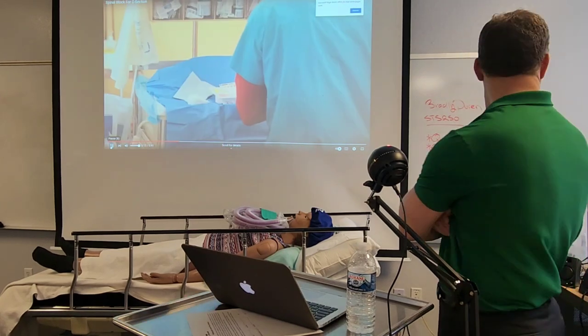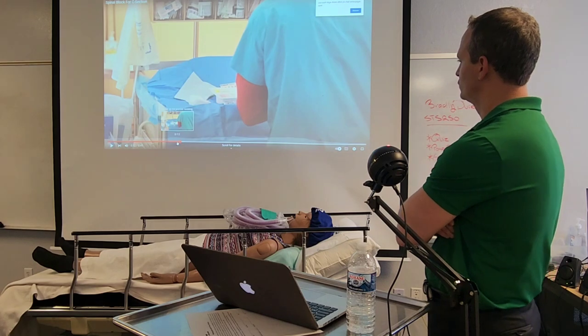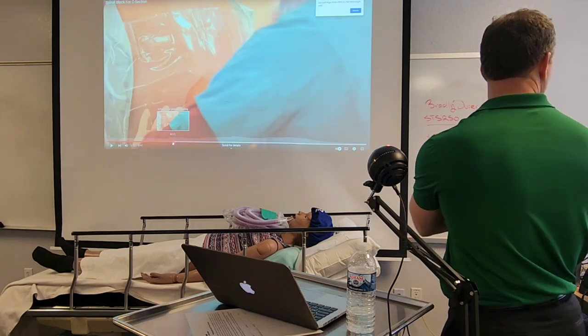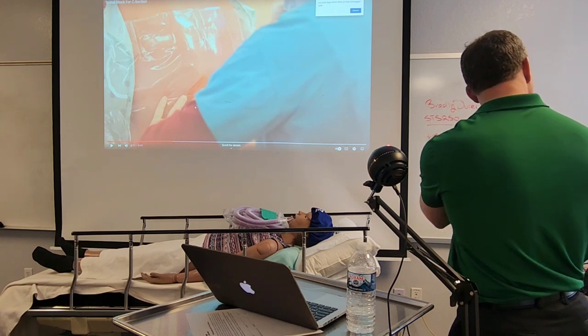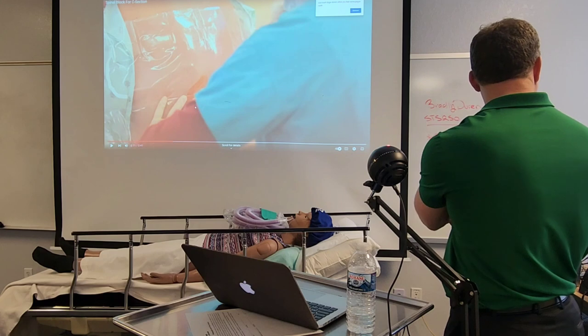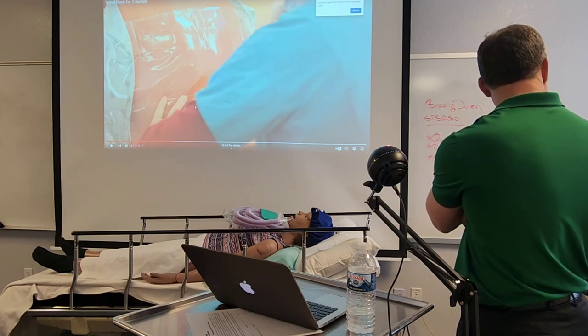Hey, can I ask a question? On that one view here, where is the sweet spot? Are you looking at L2, L3? Is that kind of a guide for you? And he said something about a horse's tail. Is that where you're trying to look for it to branch down?